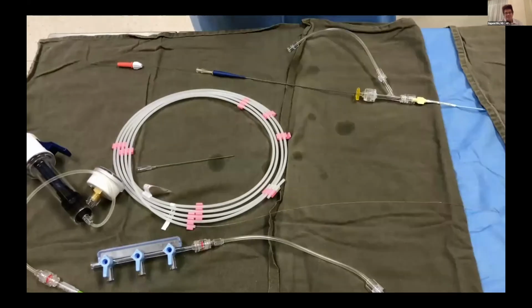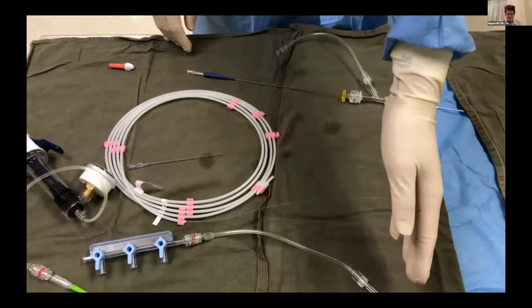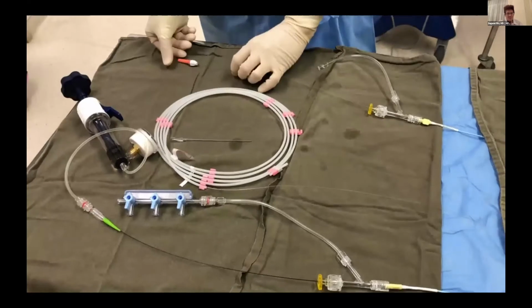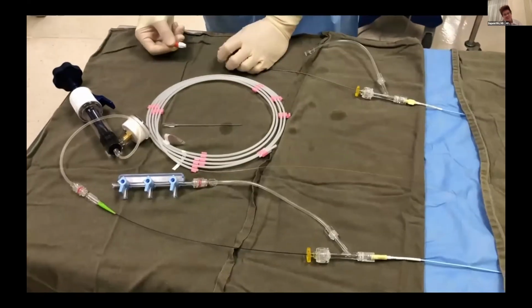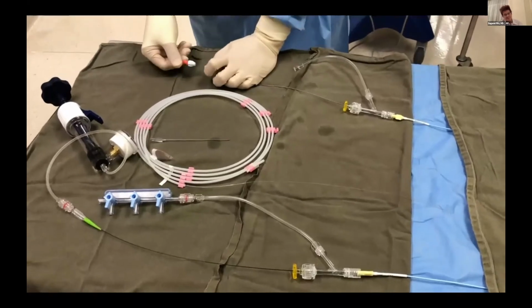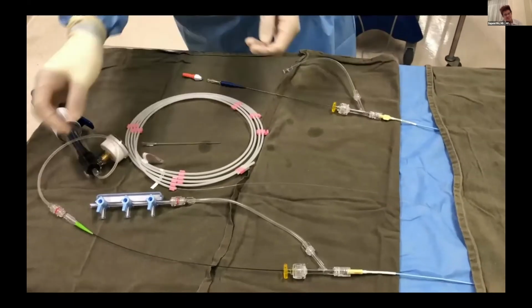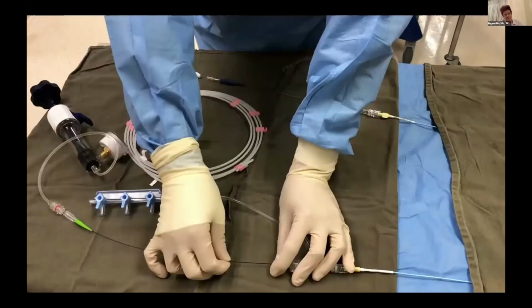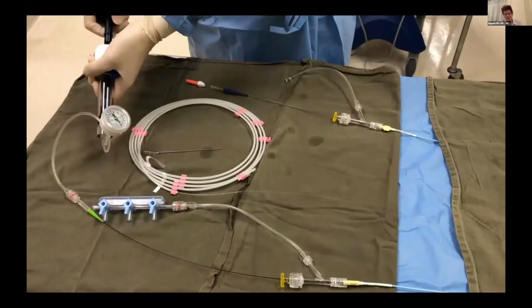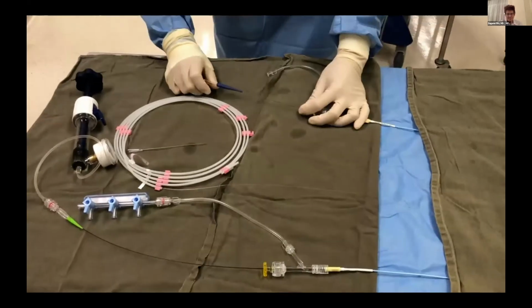So we have here the retrograde guiding catheter and the antegrade guiding catheter. And we want to demonstrate the process of wire externalization. So when you're doing your CTO and you manage to cross the lesion, you'll try to wire the antegrade guiding with the retrograde wire. After you successfully wire the antegrade guiding, you place an anchor balloon on this side to trap the retrograde wire by inflating this and trapping the retrograde wire. With this, you have great support to push the retrograde microcatheter across the CTO and into the antegrade guiding.